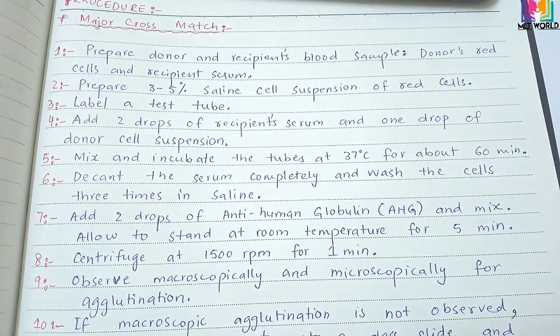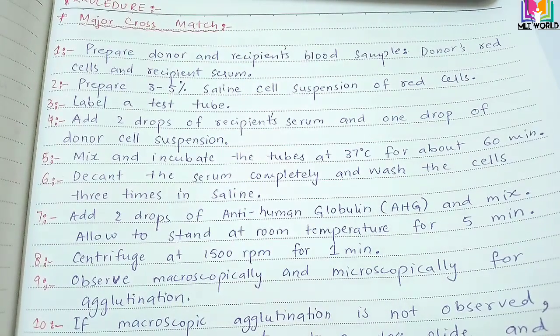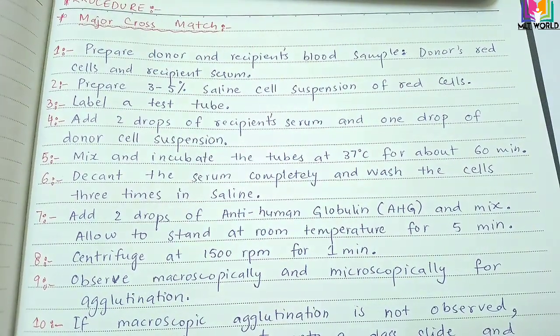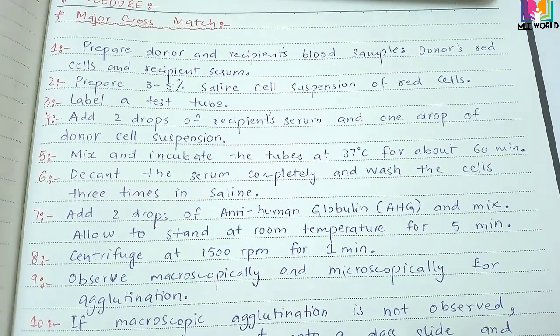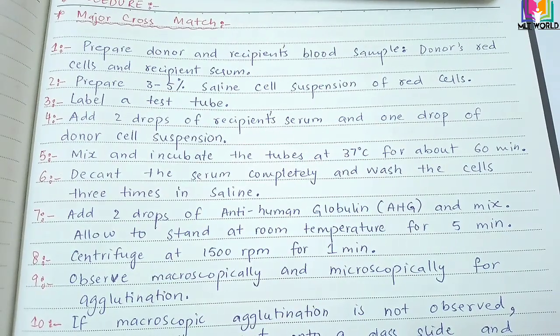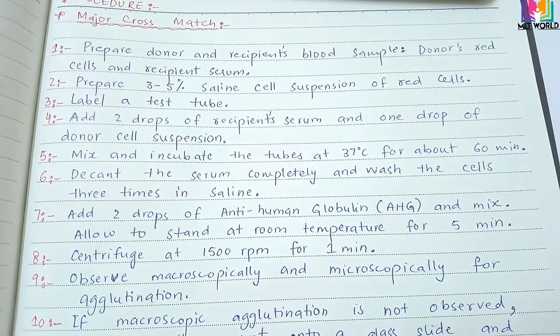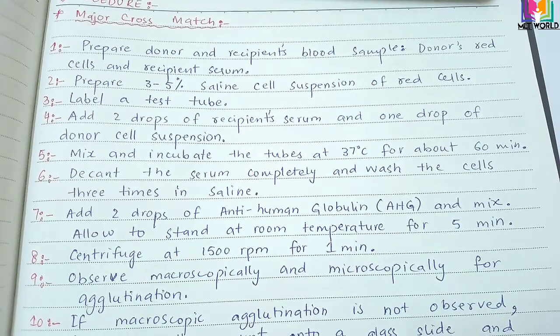Macroscopically means with your eyes, and microscopically means under the microscope. If there is no macroscopic agglutination, meaning you do not see any agglutination with your eyes, then you will go toward the microscopic check, meaning you will check for agglutination in the microscope.